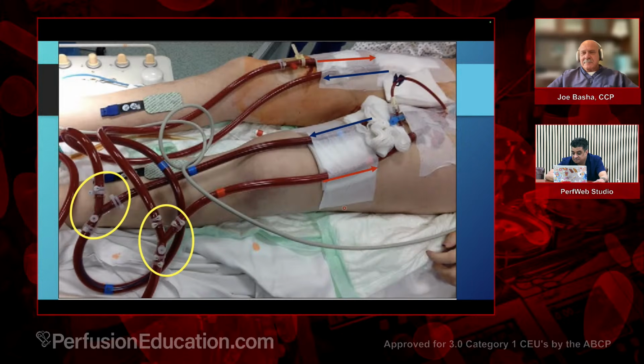Recirculation. Nope. How much did they wager? They didn't put a wager. Another one is, the oxygenated blood going in is being drained out of the venous line. Nope. Nope.